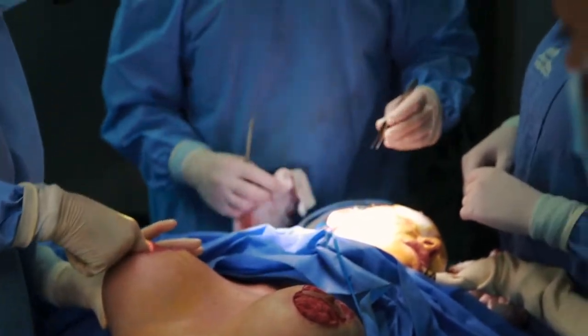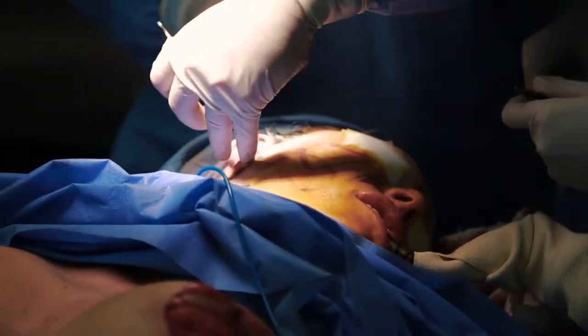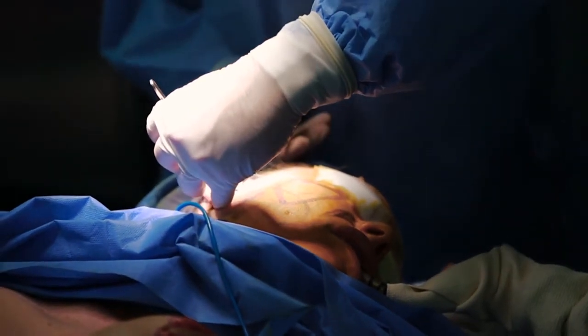What I am doing up here is the skin resection part of the facelift. We have lifted the muscle internally, we have pulled the skin back, and now I am taking off the excess skin that we very precisely marked. That will tighten everything up.